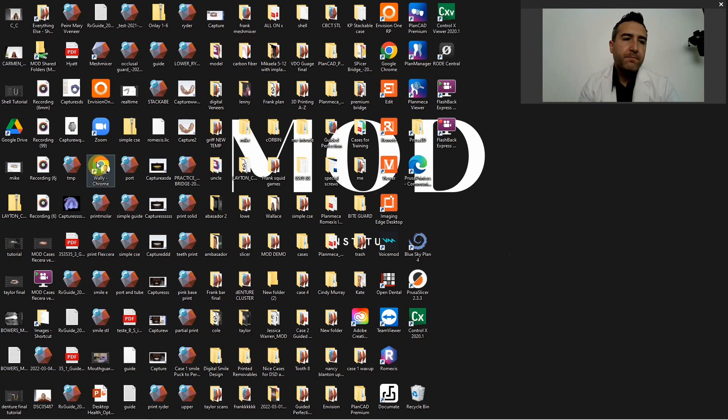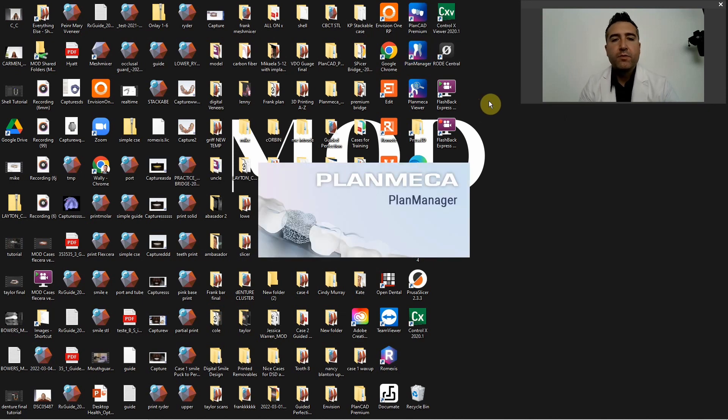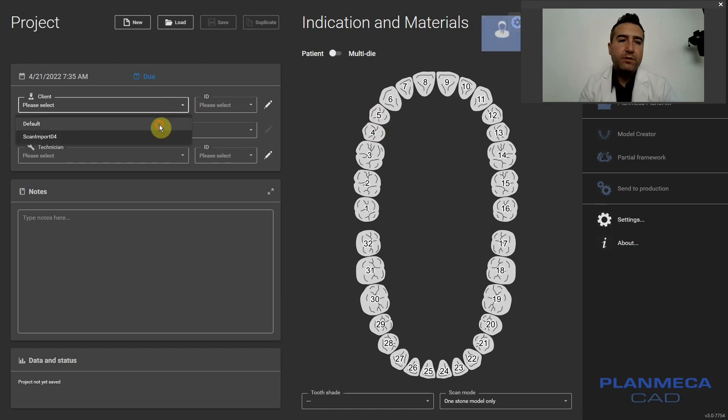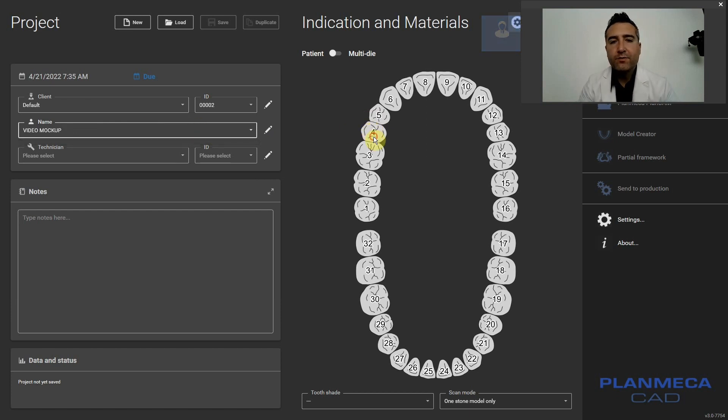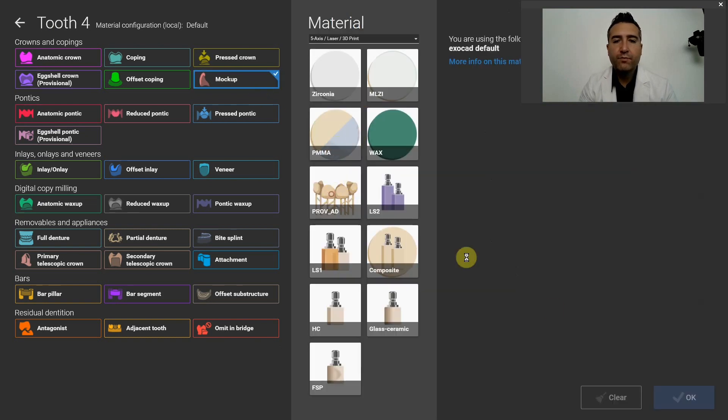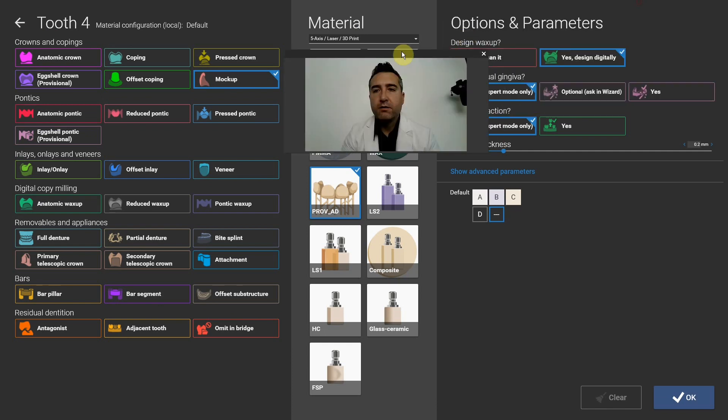So let's go through this — it's a really easy thing to do and I'm going to go through it quickly because I'm pressed on time today. The first thing you're going to want to do is open up your ExoCAD — in my case PlanCAD Premium, which is PlanMeka Optimize ExoCAD. We're going to set the case up. They actually have a module called Mockup, and it's specifically designed exactly for this. I usually do default. I'll call this 'video Mockup.' Typically I do premolar to premolar, depending on the case. So let's go ahead and pick Mockup. We'll 3D print this.